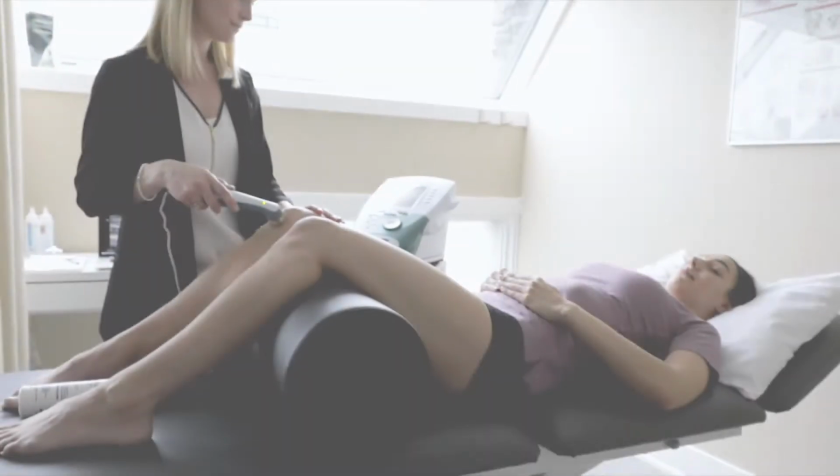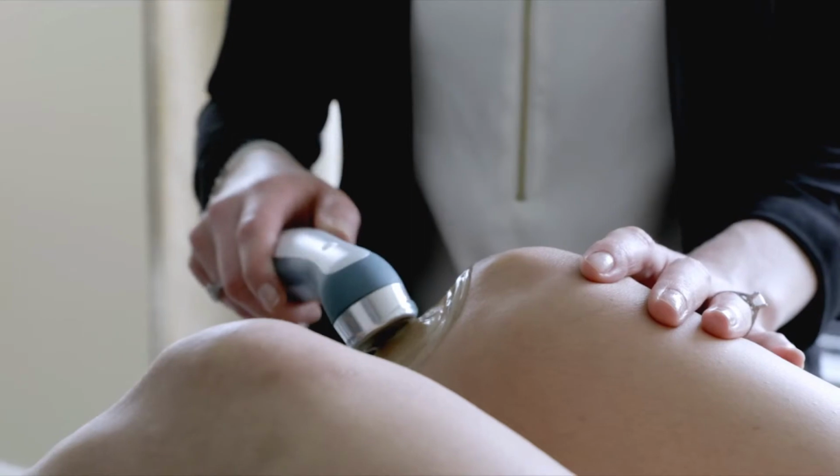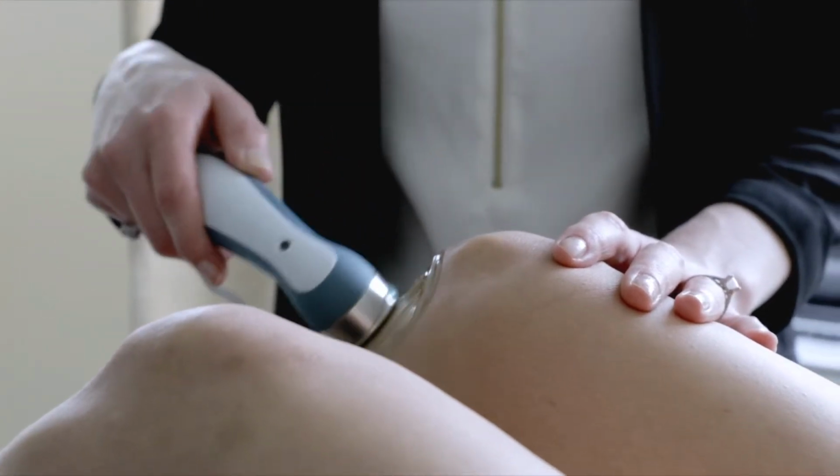The next technique that's used is ultrasound. There are many, many papers touting the value of ultrasound. We've tried ultrasound repeatedly in Southern California in our sports medicine population that we deal with. And we've always found that ultrasound can detect a lot of injuries, but it can't detect all the injuries around a joint like MR can. So almost always after there's an acute injury, even if ultrasound detects an injury, we end up having to go to MR before deciding on surgery.